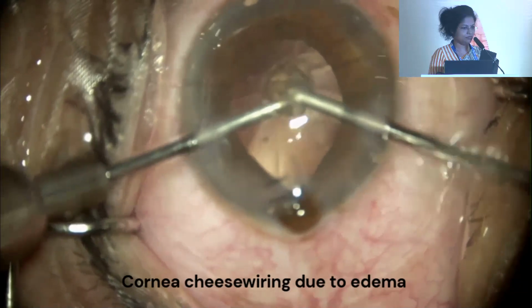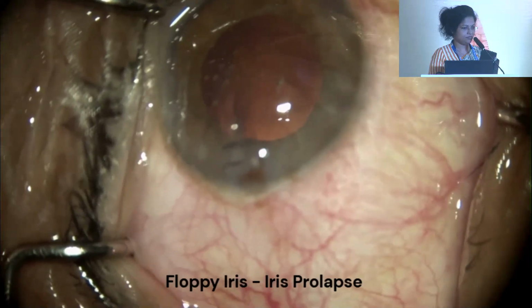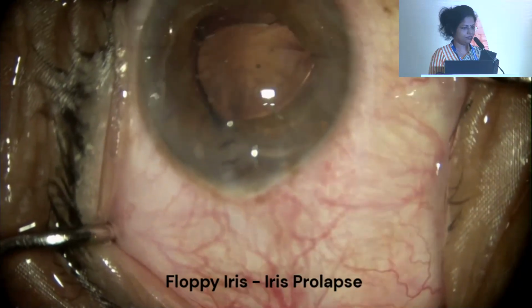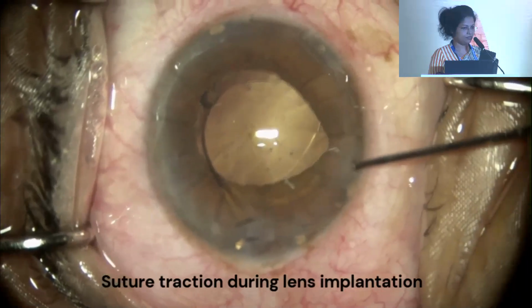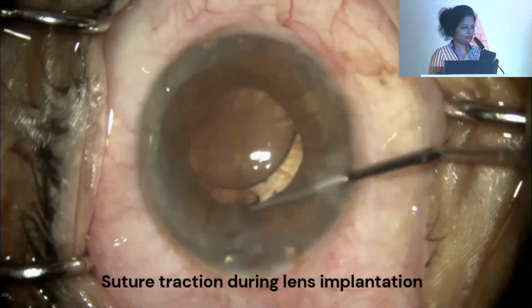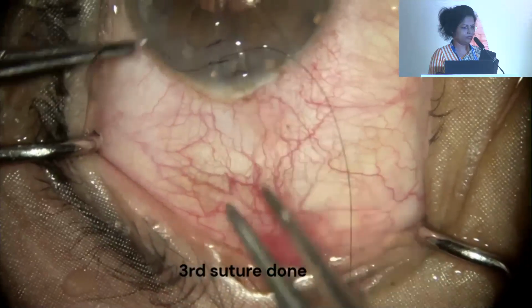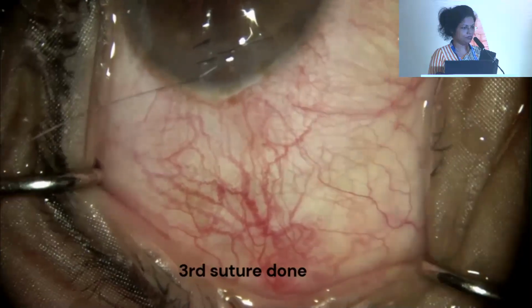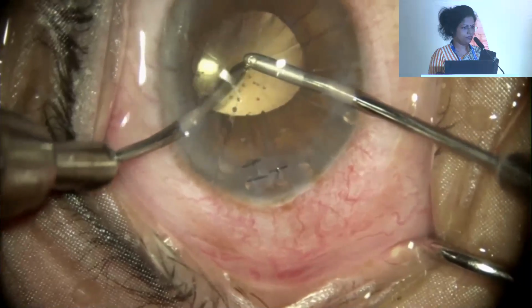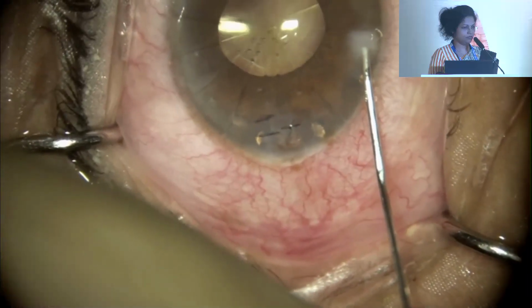You can notice because of this, how the iris is fluffy and the iris prolapsed. So now we are implanting the lens. During implantation, obviously there is suture traction also. The lens is implanted inside the bag, and now we are taking another third suture to close the wound and make sure there is no gap. After that we did the IA and closed the wound properly, and all 3 ports are closed.